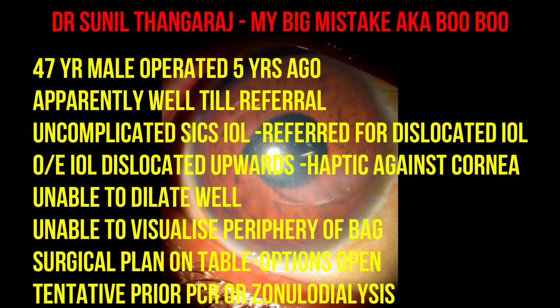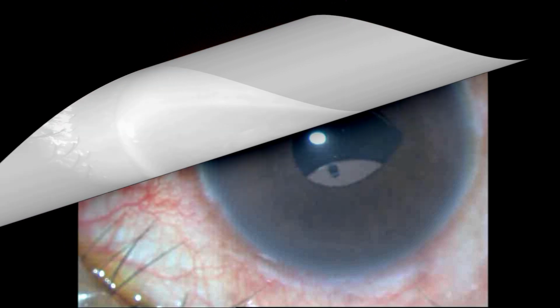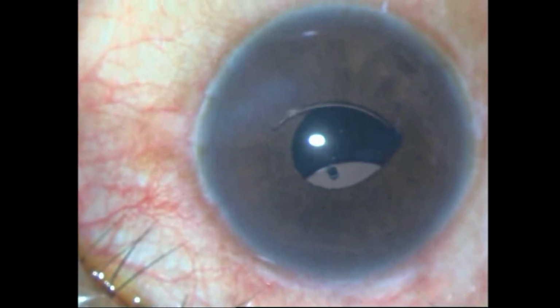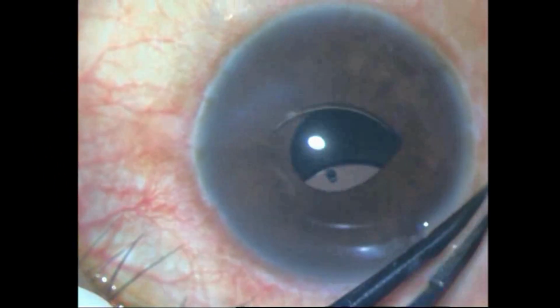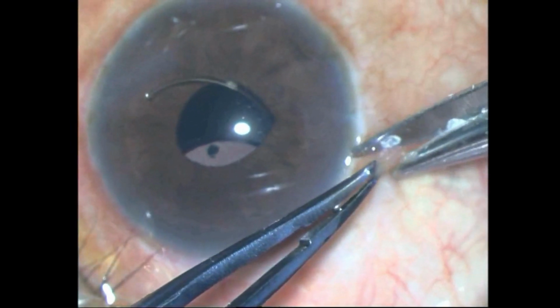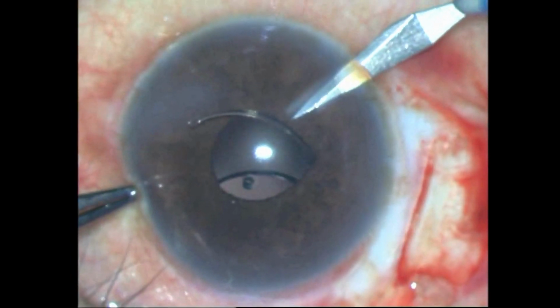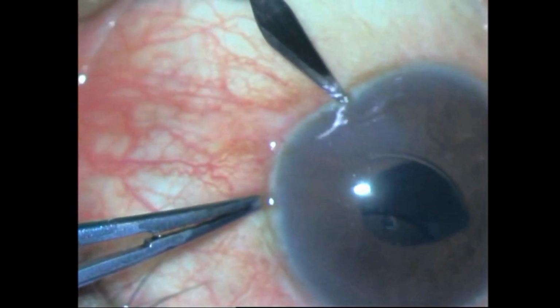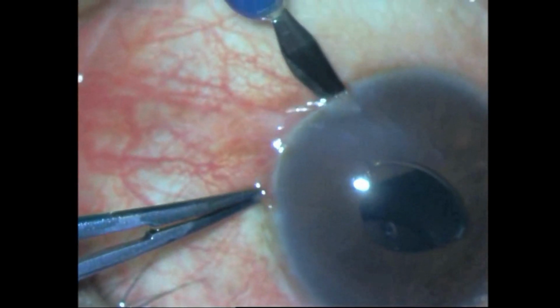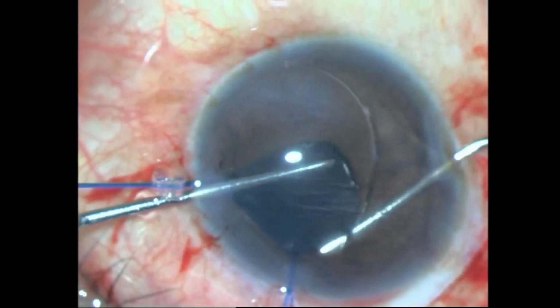Now you can see from the picture that the haptic is rubbing against the cornea and the IOL is dislocated upwards. So since there was an incision superiorly, I decided to make a temporal incision, a valve incision. I put in some side port incisions as well. And my idea was first to dislocate this IOL with the help of iris hooks into the anterior chamber. And very easily I could dislocate this IOL into the anterior chamber.